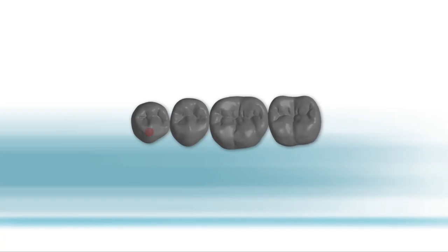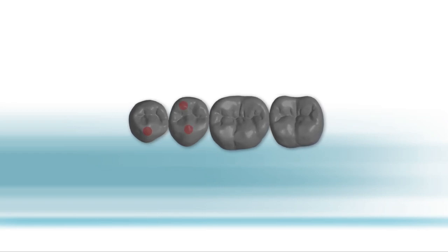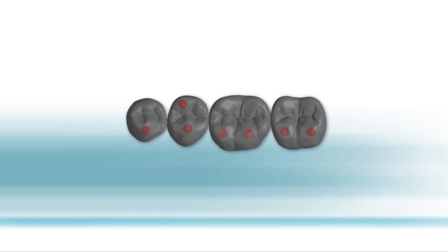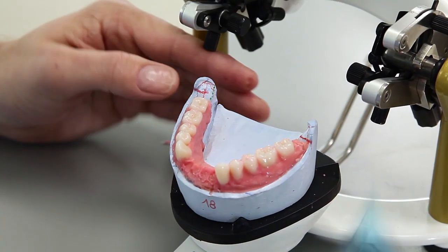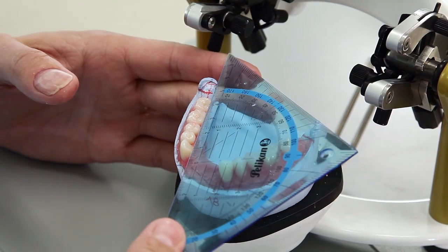The first premolar with buccal cusps. The second premolar with buccal and mesiolingual cusps. The first and second molar with mesio and distobuccal as well as mesiolingual cusps. Check whether the teeth are correctly positioned within the functional corridor.